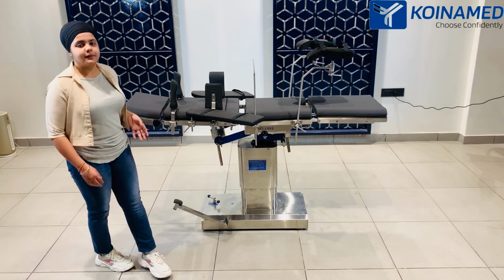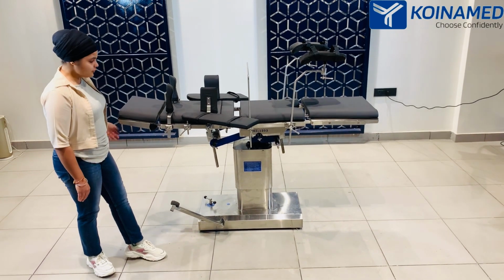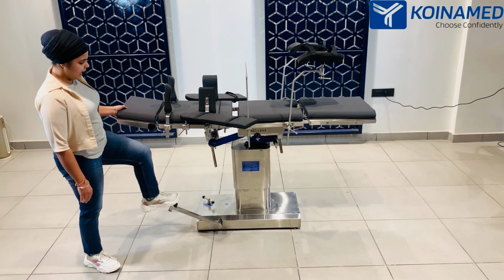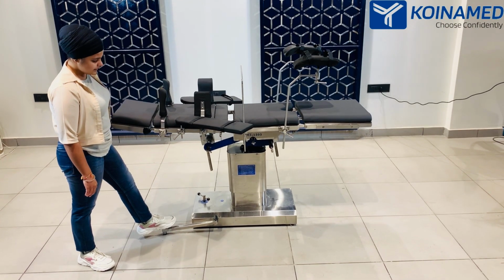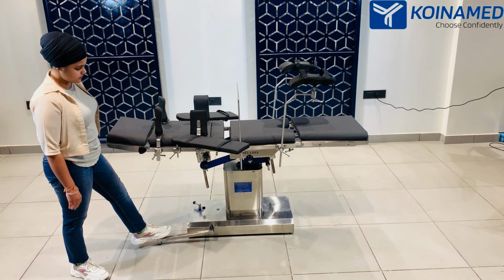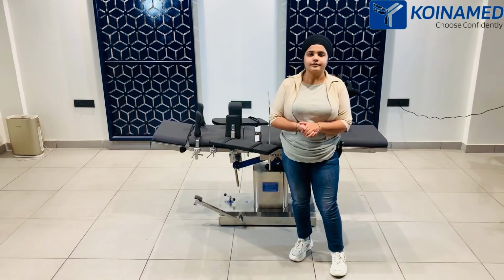And when you have to make the table go downward, what you need to do is put pressure on the pedal and make it touch the floor, just like this. You can see the table is coming downwards. The minimum and the maximum height of the table is 750 mm to 1000 mm.